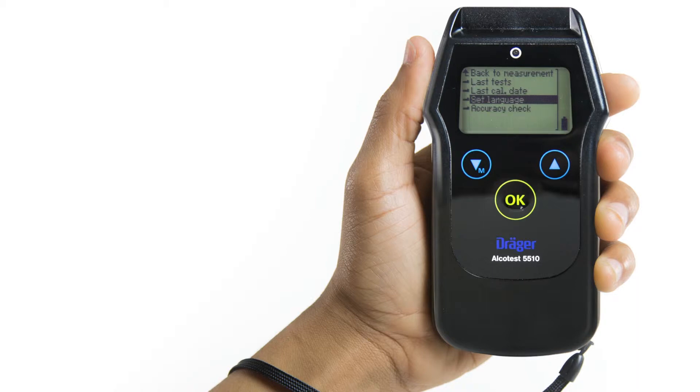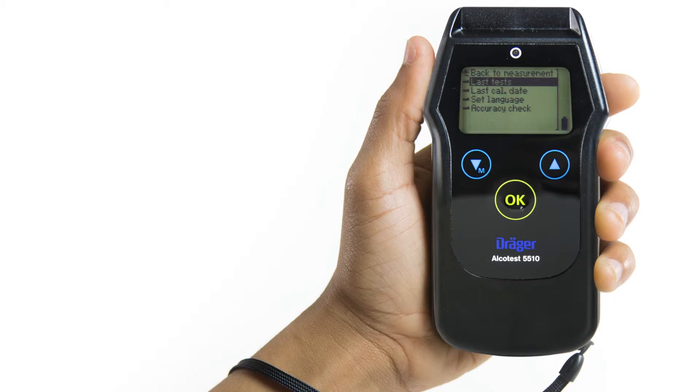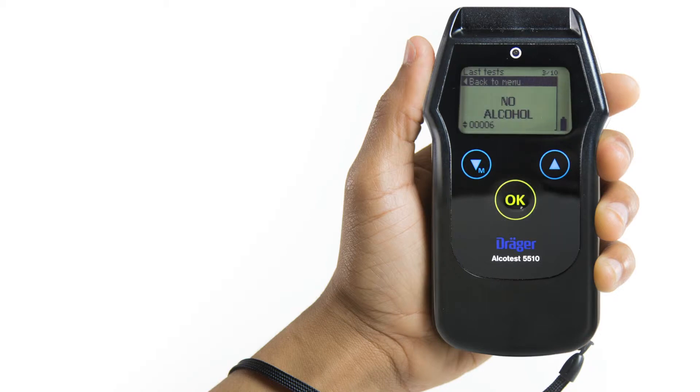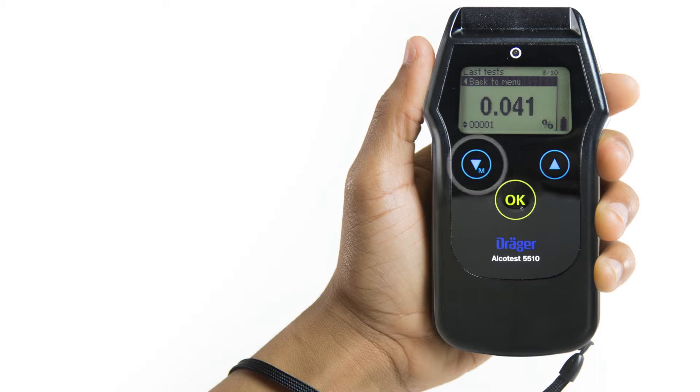The Last 10 Tests menu displays the results of the last 10 breath tests with the test number in the lower left corner. To navigate through the stored tests, use the up and down arrow buttons.